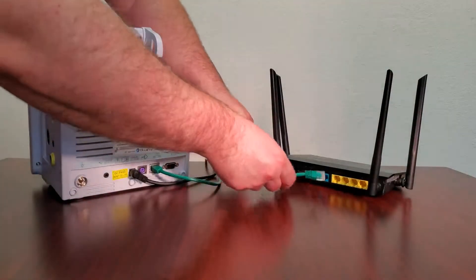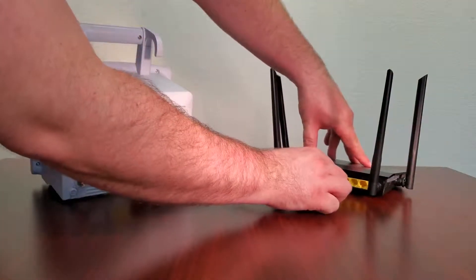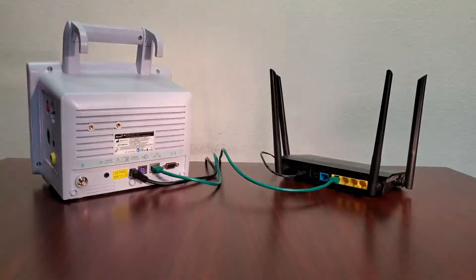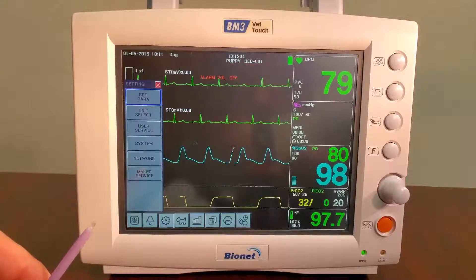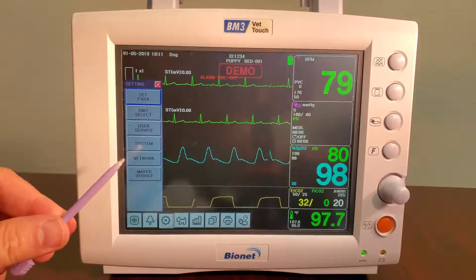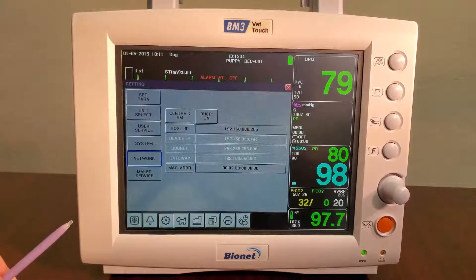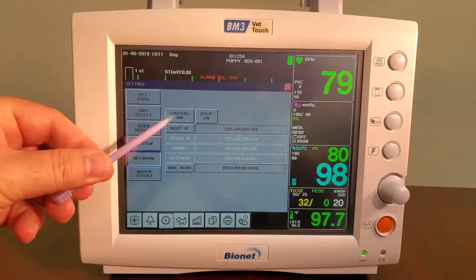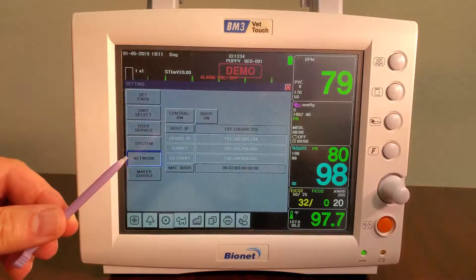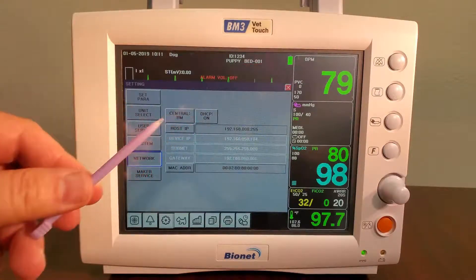Connect your Bionet patient monitor to an internet router using an Ethernet cable. On your Bionet patient monitor, click the gear icon to access settings. Click Network, and ensure that Central is set to BM or BT, and that DHCP is set to ON.